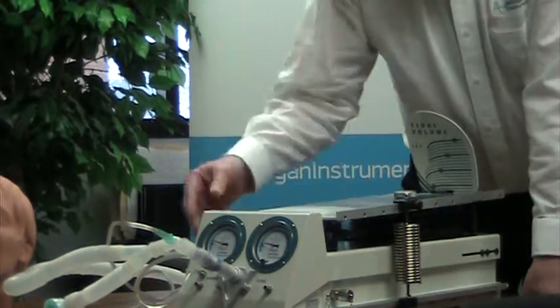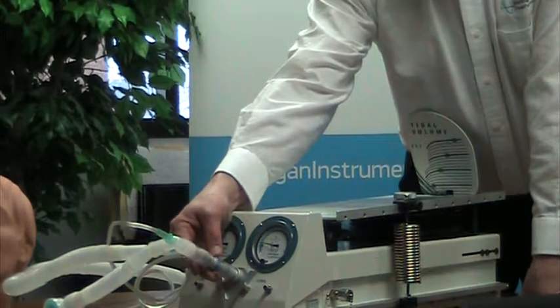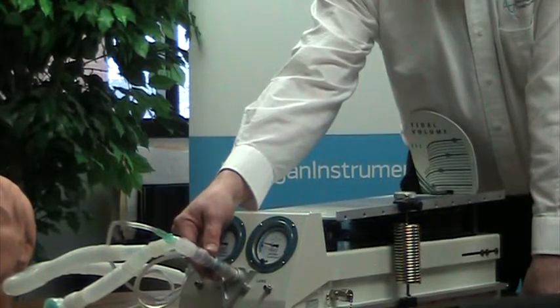The units also come with a variety of airway resistors. These are fixed orifice resistors. They're placed in the airway to simulate different resistance.